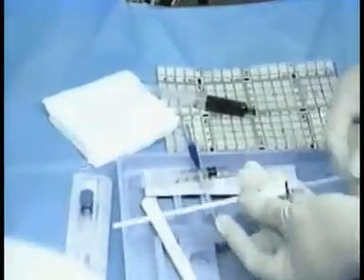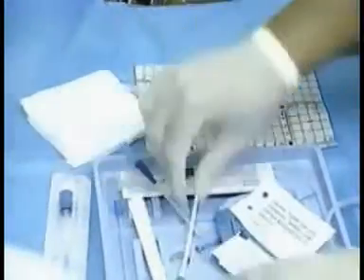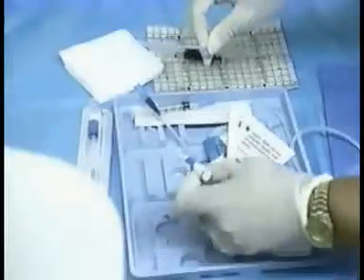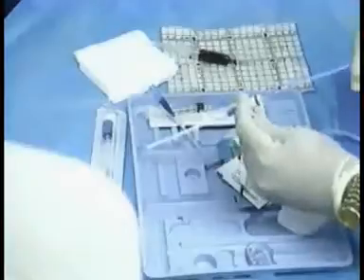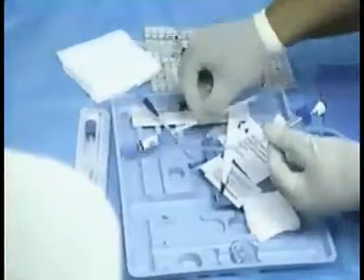In this case, an introducer is being placed for a pulmonary artery catheter. The dilator is placed through the lumen of the introducer sheath, and the two are advanced together as a unit over the guide wire. Note the side port through which you can infuse IV fluids.